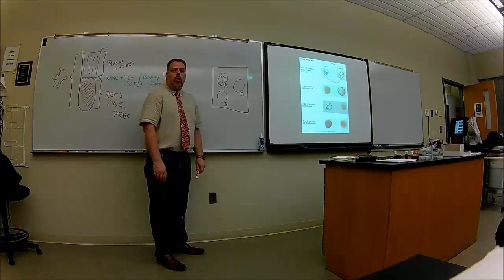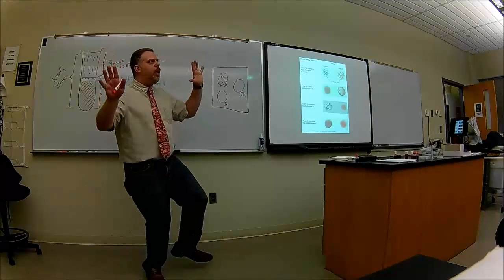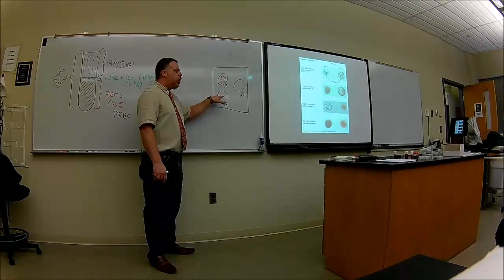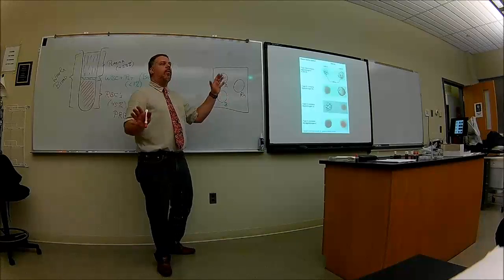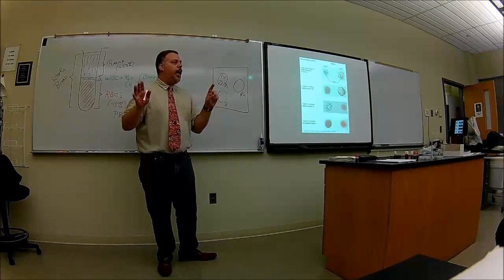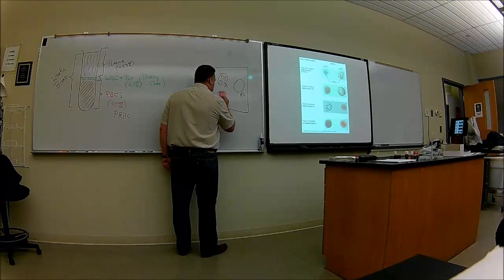Now, you put 3 drops of antibodies to B in the well of B. So now you have B antibodies floating there. You put 1 drop of the same blood that you put here, you're now going to put it in here. Clear with that? You put a drop. Here's the antibodies to B. Bloop. What is antibodies to B looking for? Antigens to B. But it doesn't see it there. So they're not going to clump. Instead, it'll just look like this.